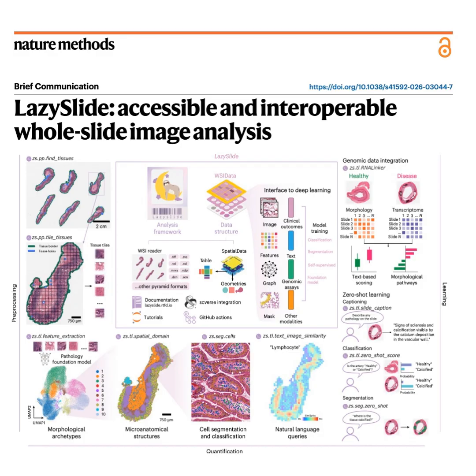But to generate a single calcification score for the entire patient, the system used a mechanism called top-K pooling. Top-K pooling? How does that work? Well, instead of averaging the scores of all the tiles, which would heavily dilute the signal, since most of the artery actually isn't calcified, top-K pooling isolates just the top K number of tiles that have the absolute highest similarity scores. Oh, so it just takes the most confident hits and pools them together to say, yes, this slide exhibits strong visual evidence of calcification. Precisely. And those top scoring areas instantly highlighted biological terms like vascular niche and apoptosis, which is programmed cell death, as being heavily enriched in the sick arteries.